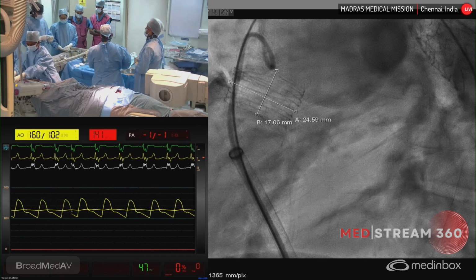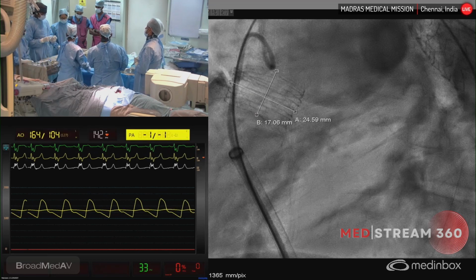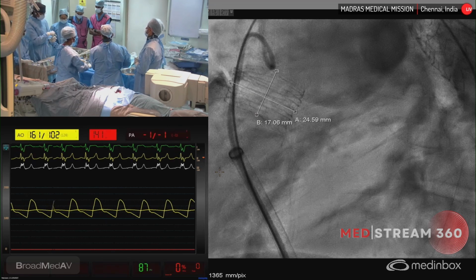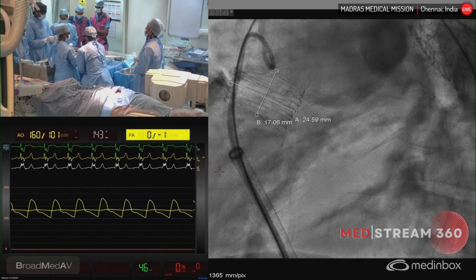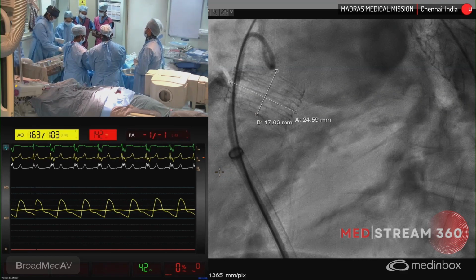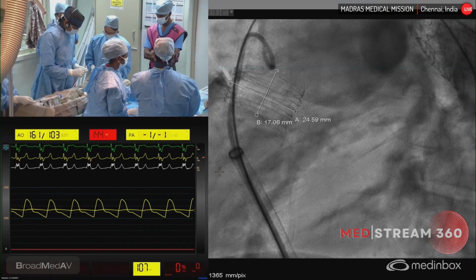Also, the blue color indicates the pulmonary end. The white color indicates the ventricular end. So I have introduced the syringe after fully opening the valve from the pulmonary end into the ventricular end, so that now I am pulling along the line of the valve itself. The next step will be, I'm going to take it onto the melody valve. I am loading it onto the ensemble system.